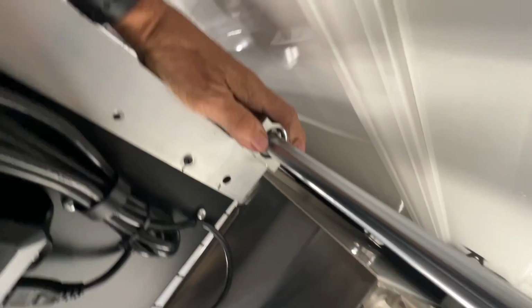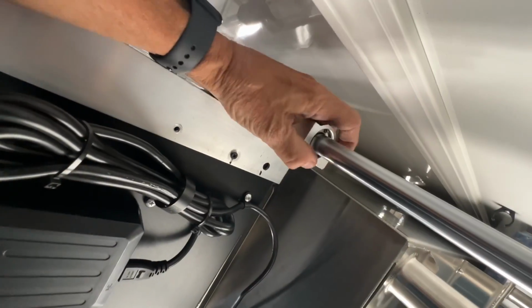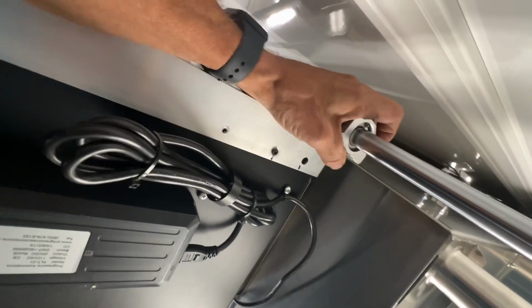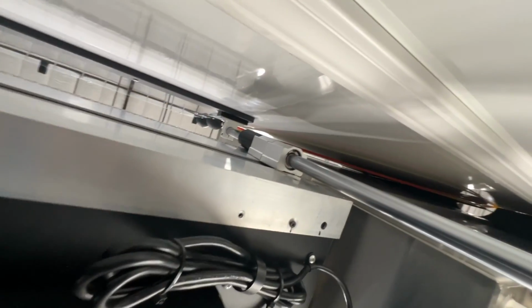Now, make sure the bearings are trapped behind the black box. This way the box can hold the bearings in place for easy access when you get ready to line up the bearing holes with the holes in the box.